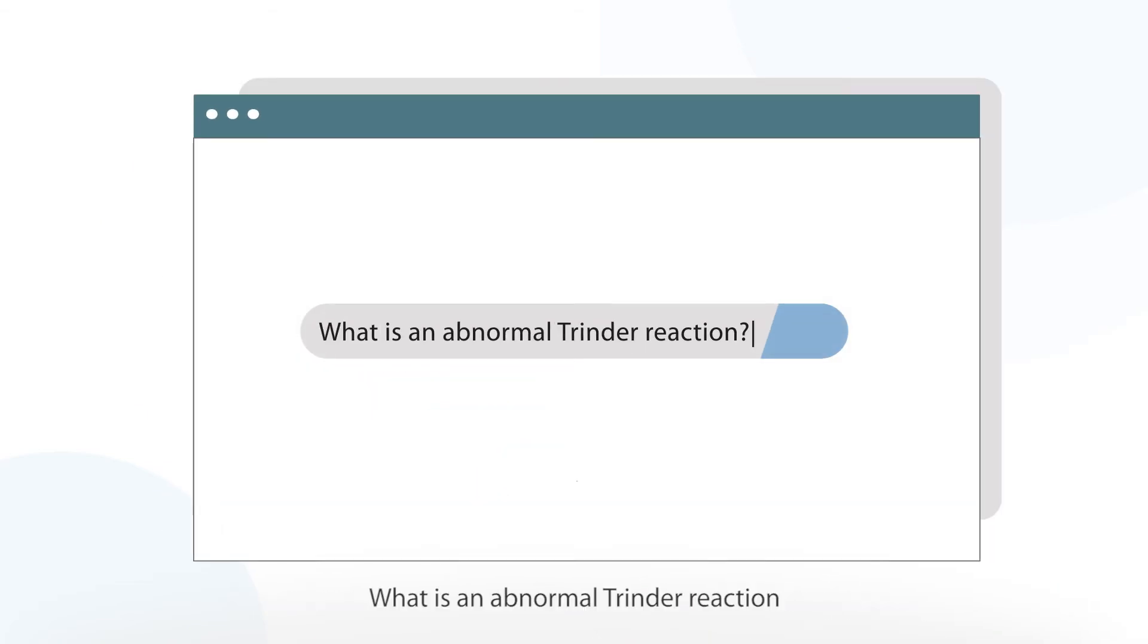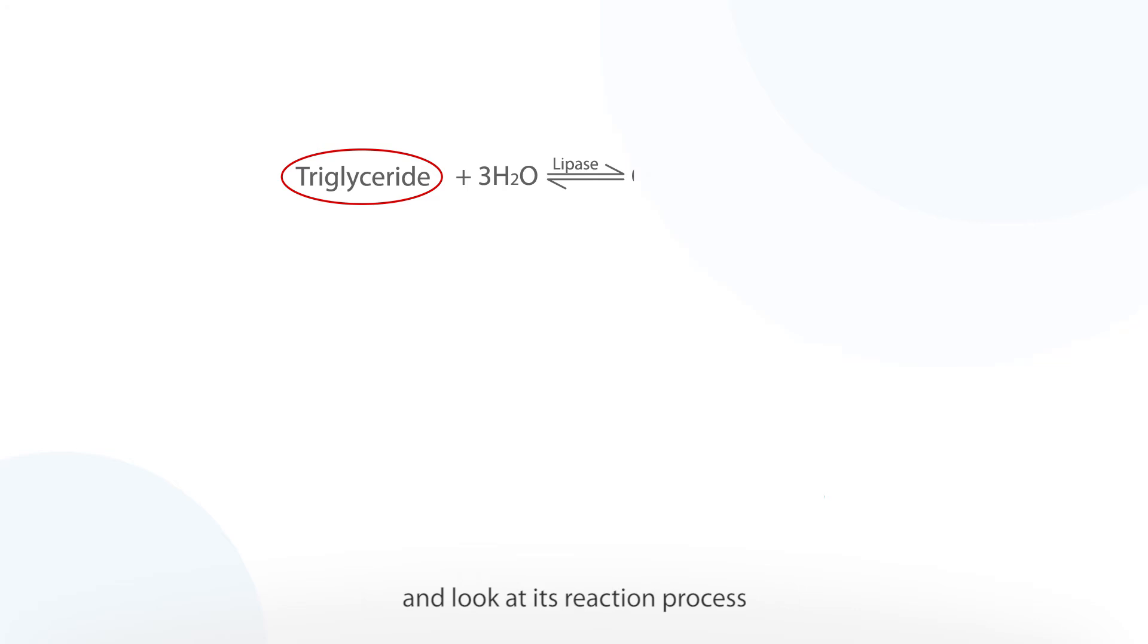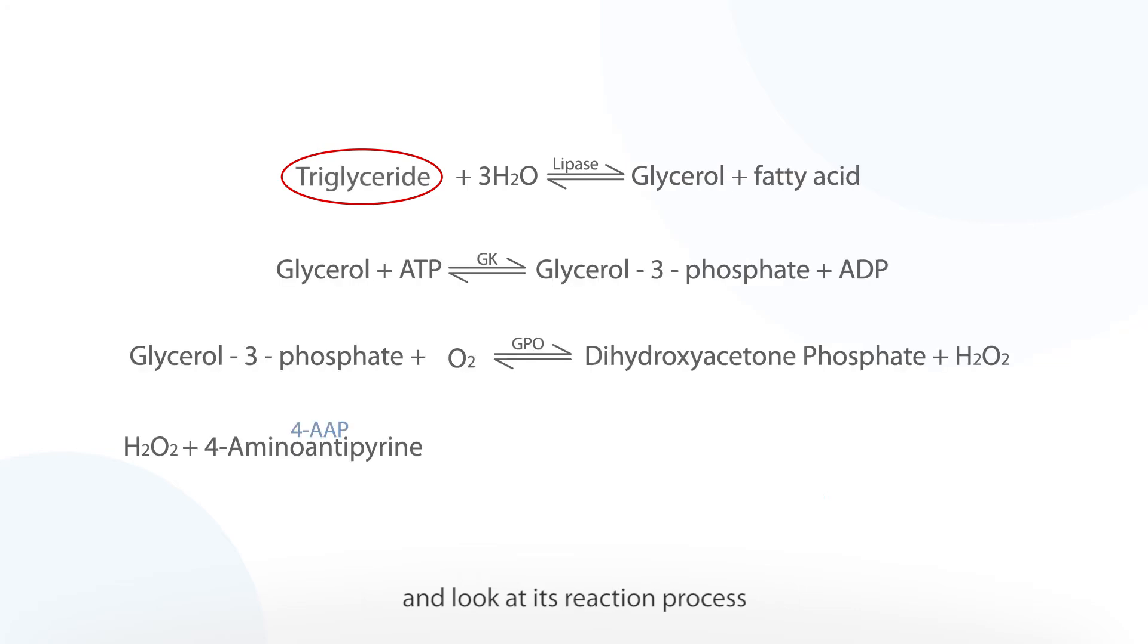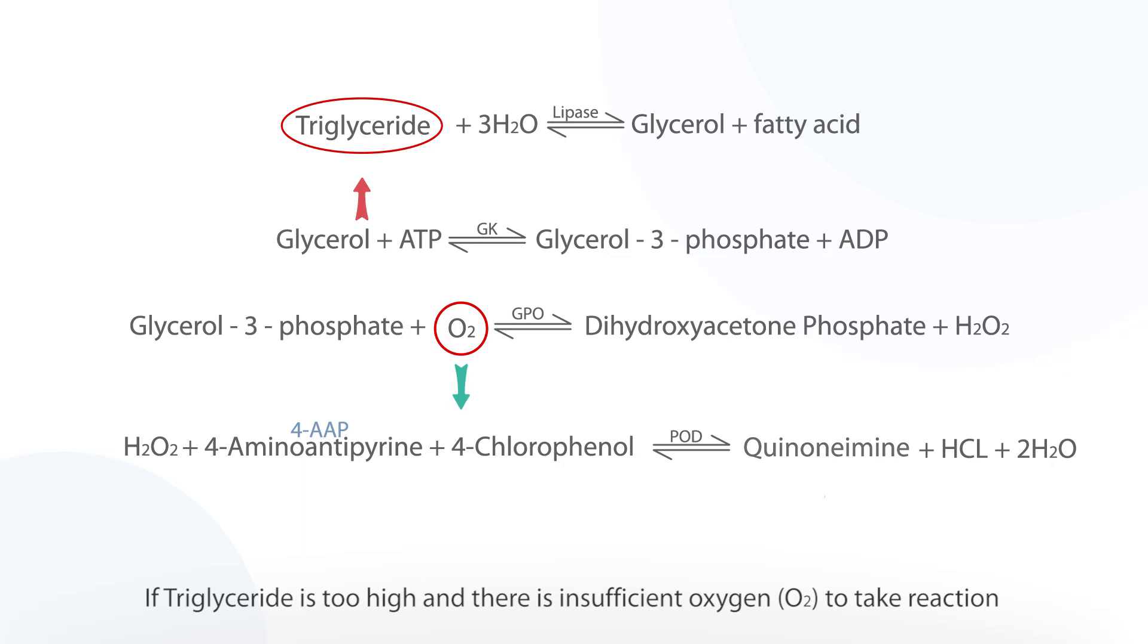What is an abnormal Trinder reaction? Let's take triglyceride as an example and look at its reaction process. If triglyceride is too high and there is insufficient oxygen to take reaction, the final product quinoneimine will first increase and then decrease.